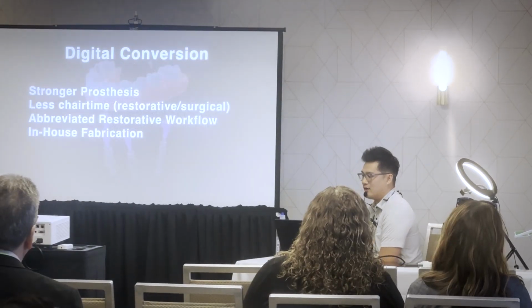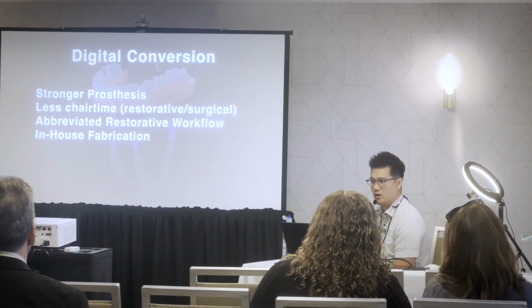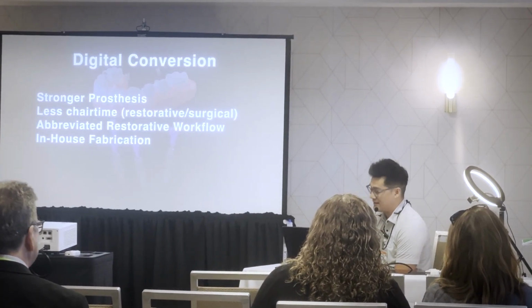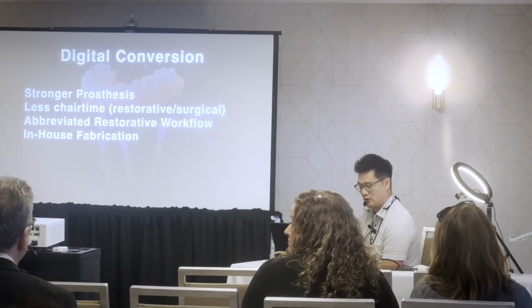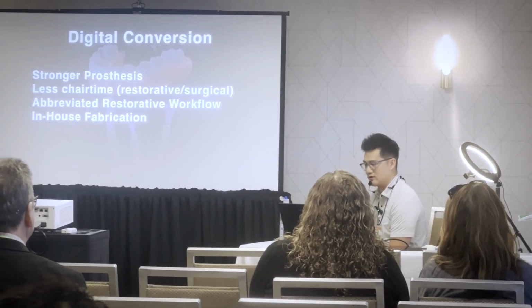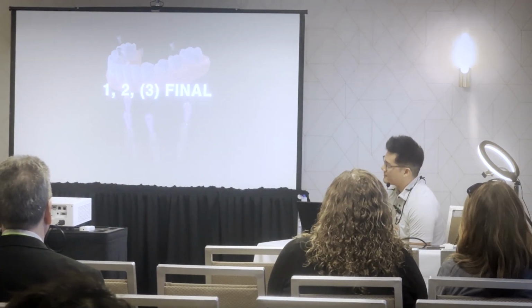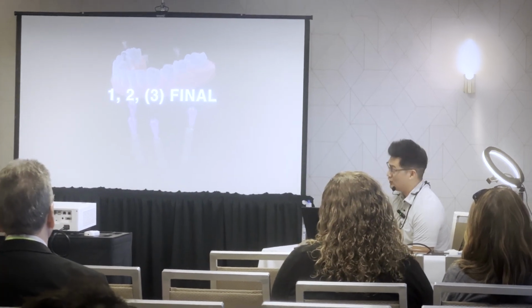And so the advantages to a digital conversion are that it's stronger. So whether I'm milling it or printing it, I'm not cutting holes in the denture. I don't get any fracture of the prosthesis. It's less chair time. There's an abbreviated restorative workflow. So usually from that temp to go to final, it's less steps. And then it allows for in-house fabrication. So if a stranger dentist has a printer, we just send them the file. So we call this 1, 2, sometimes 3 appointments to go to final, usually 2.